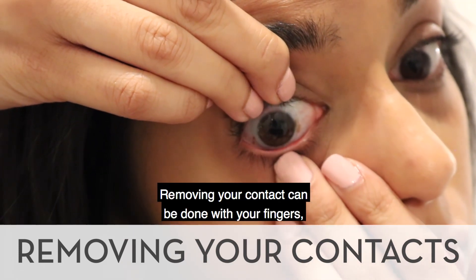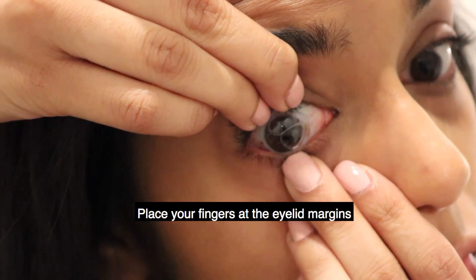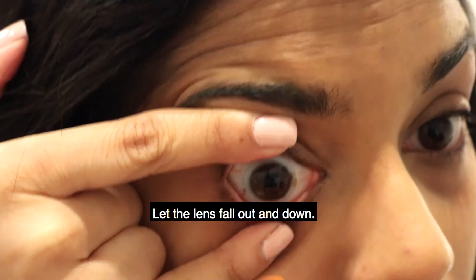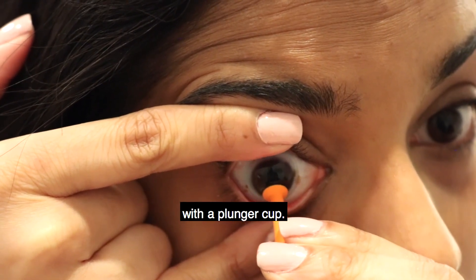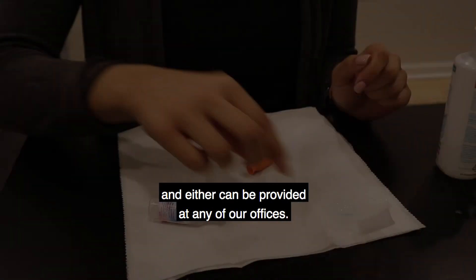Removing your contact can be done with your fingers or with a plunger. Place your fingers at the eyelid margins right next to your eyelashes and push on the top and bottom lid to break the seal between the contact and your eye. Let the lens fall out and down. Specialty or scleral contacts can also be removed with a plunger cup. Note that the inserters and removers are different shapes and either can be provided at any of our offices.